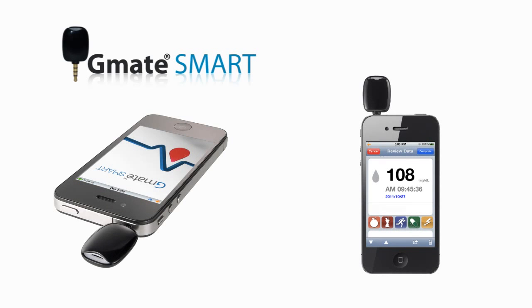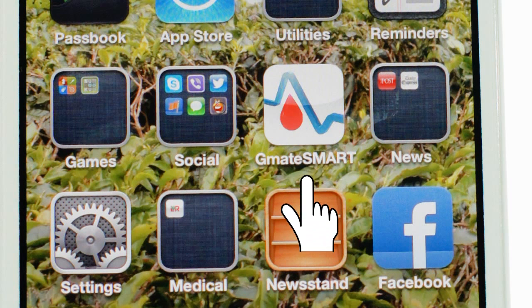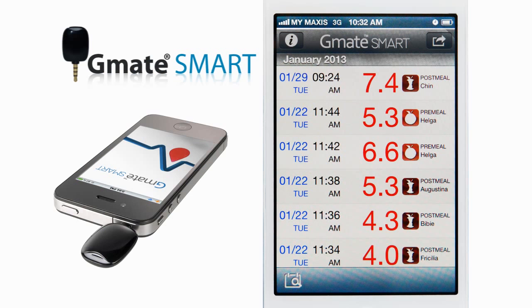Remove the test strip and touch the Save button to store the test result. Test results measured by the G-Mate Smart system are stored in the smartphone. You can review your test results whether or not your G-Mate Smart meter is connected to the smartphone. Touch the G-Mate Smart application icon on your smartphone — the test results will display as a list, with the most recently measured result at the top of the screen.